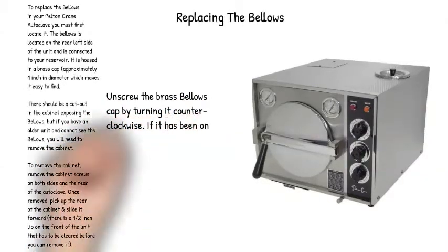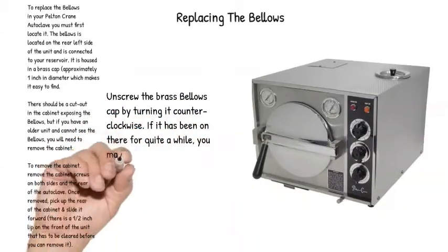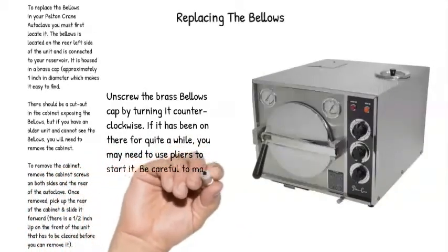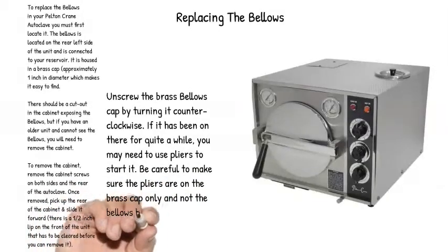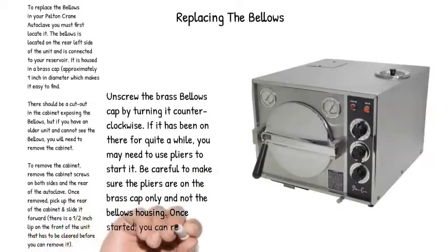Unscrew the brass bellows cap by turning it counterclockwise. If it has been on there for quite a while, you may need to use pliers to start it. Be careful to make sure the pliers are on the brass cap only and not the bellows housing. Once started, you can remove it the rest of the way by hand.